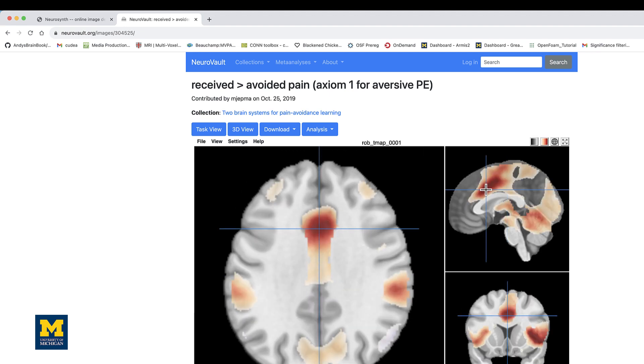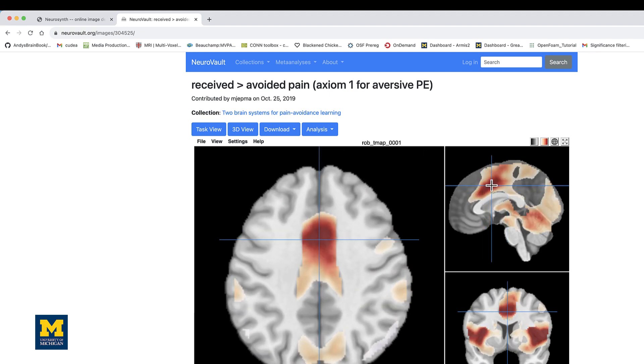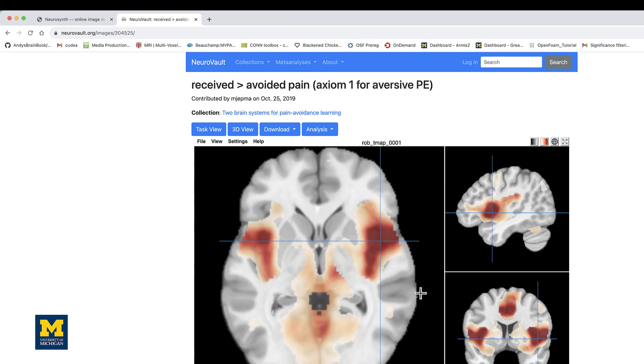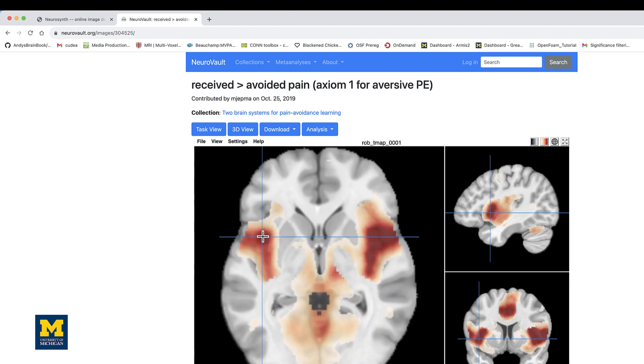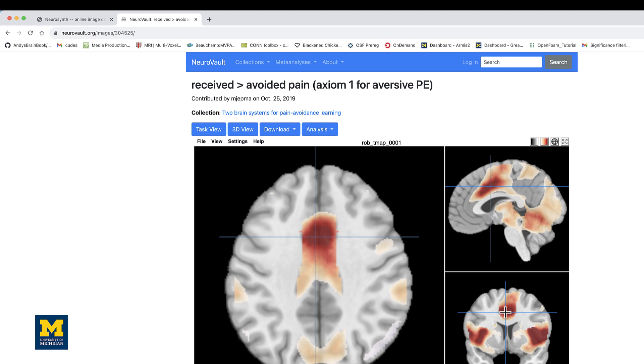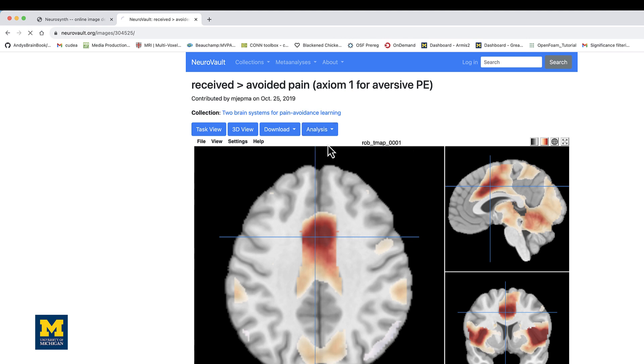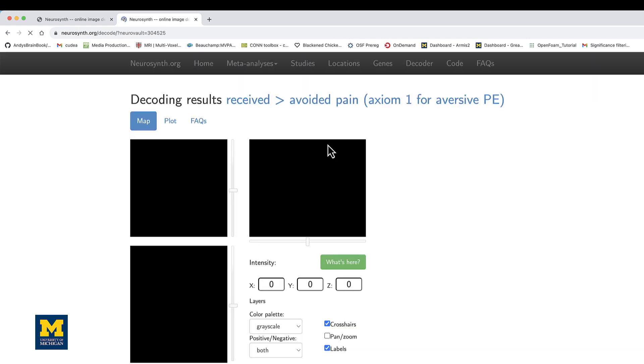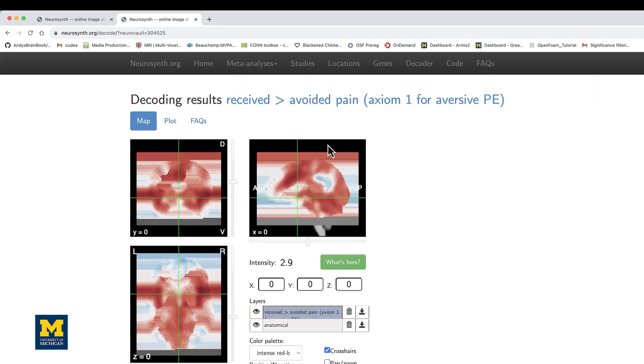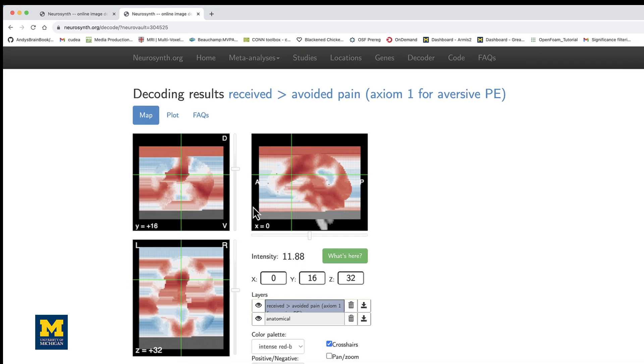Which shows a high degree of activation in the dorsal anterior cingulate and bilateral anterior insula, a common pattern that's seen in response to painful stimuli. If we want to analyze this using Neurosynth's decoder, click on Analysis and then Cognitive Decoding Neurosynth. This will take you back to the Neurosynth page with that specific contrast loaded.